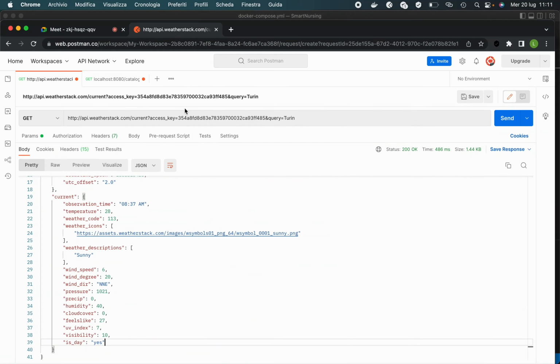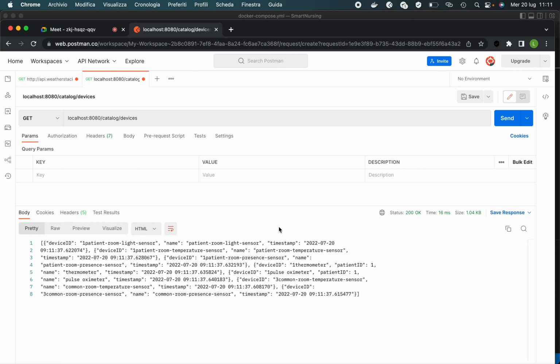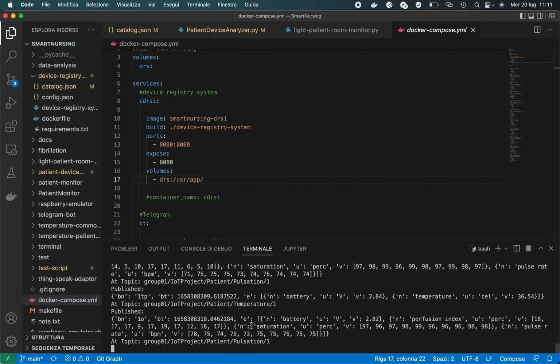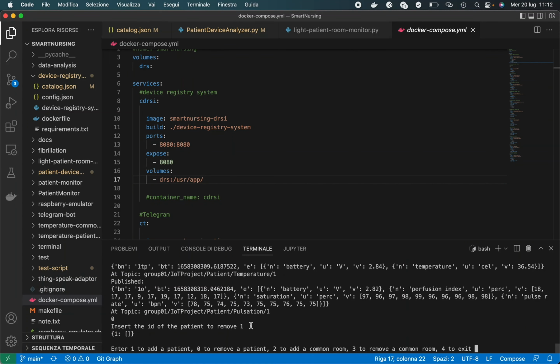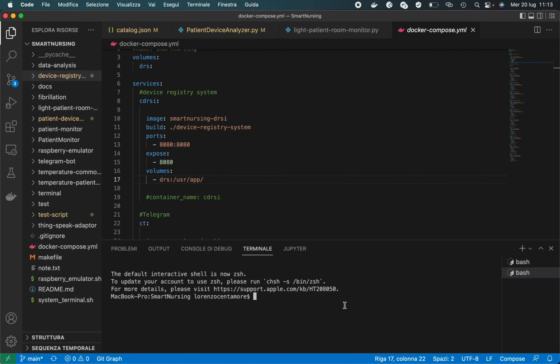From now, the Raspberry emulator will start emulating data for the room and patient 1, together with data emulated for the common room 3 that I've added. It will also receive actuation commands. From Postman, as you can see, I can see the devices registered by the gateway.